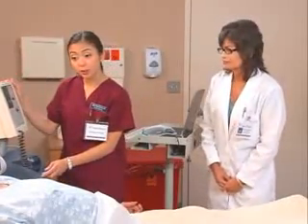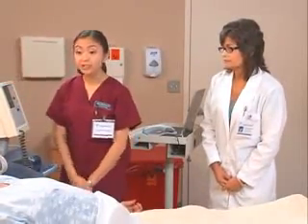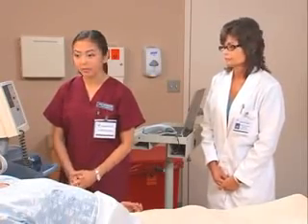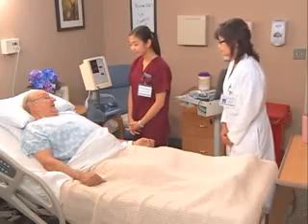I'm going to be putting this blood pressure cuff on you. It will inflate each time to measure your blood pressure, but in between, it'll be deflated without any pressure on your arm. Doesn't look too different from the other one. Except this one's electronic. We put the cuff on the same way as the auscultatory method, you know, the other kind. Except this one has a little microphone or pressure sensor that'll position directly over the artery.